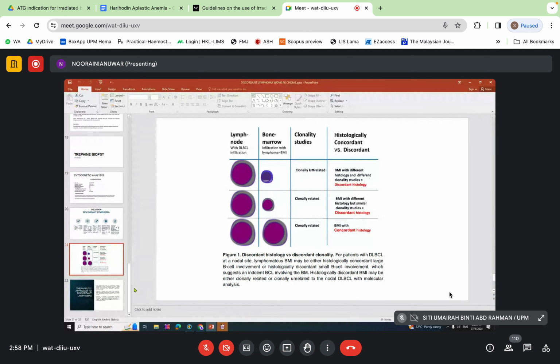Blood smear will be difficult because you have to scrape it. I'm not sure whether you still have remaining slides. But the trephine block should be okay. You just need to cut some sections and send them. They don't require too much DNA to be extracted, and then they can amplify it. Yeah, good suggestion.